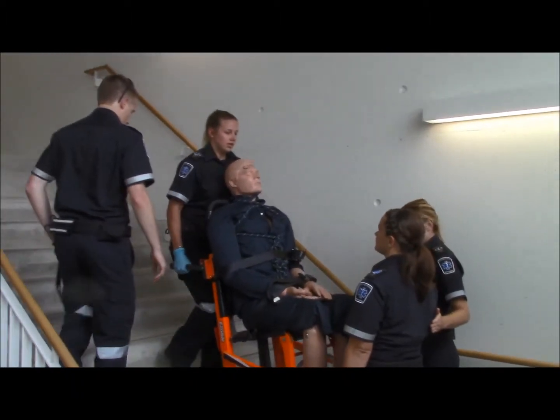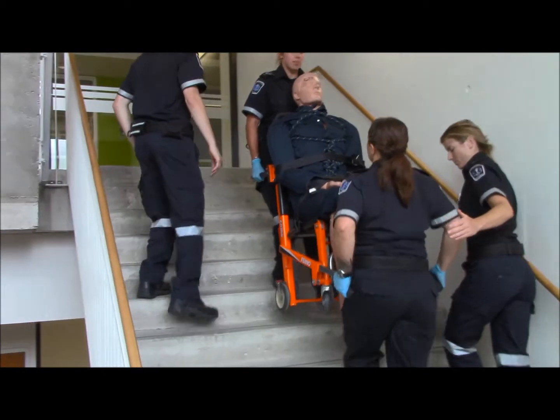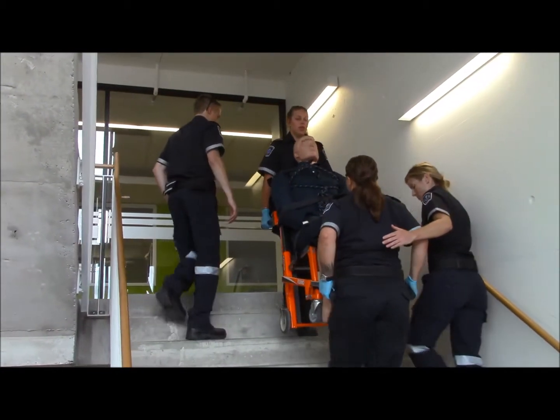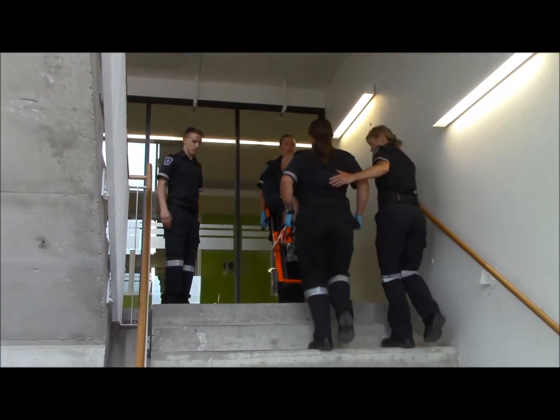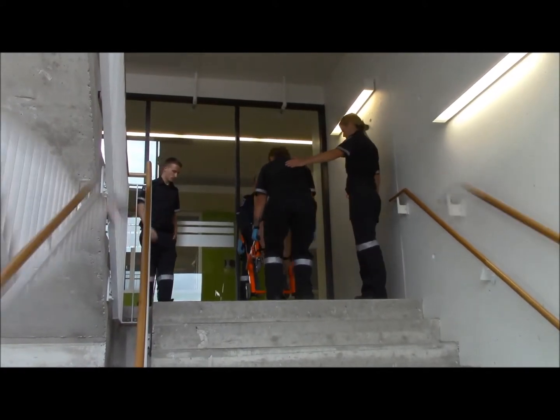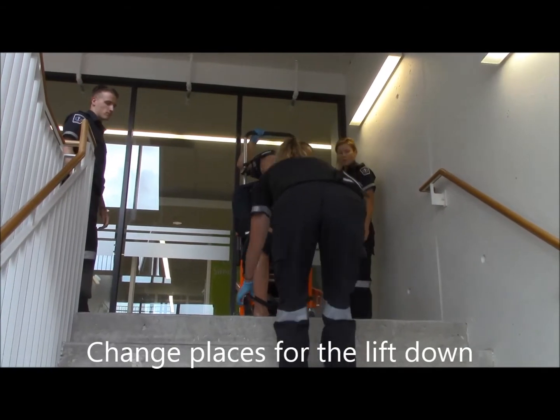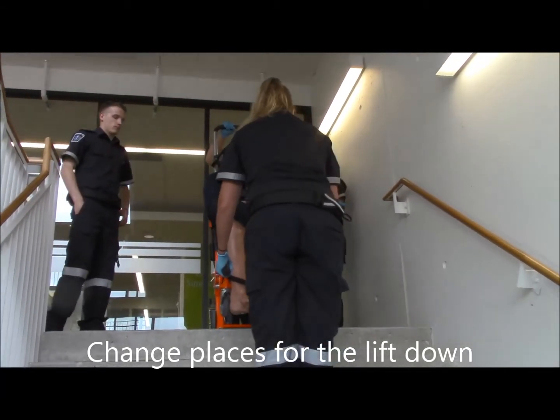Just a reminder to continue to communicate with your partner in the form of step, step, step, and that's the person at the head end to begin with. Once you've changed places, you'll begin the descent, and you'll notice that there is a handle that comes out of the top of the stair chair here up at the head end.